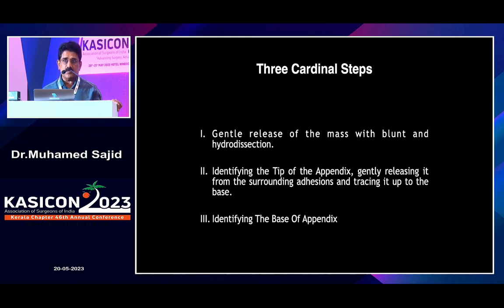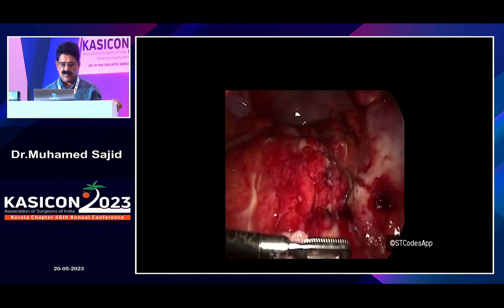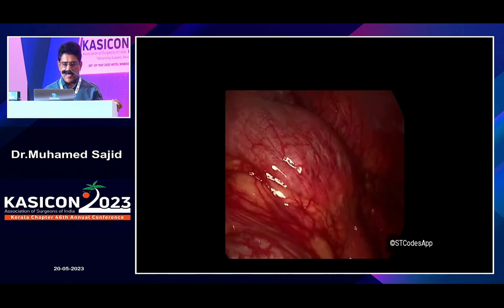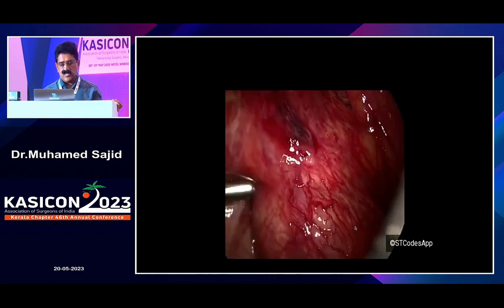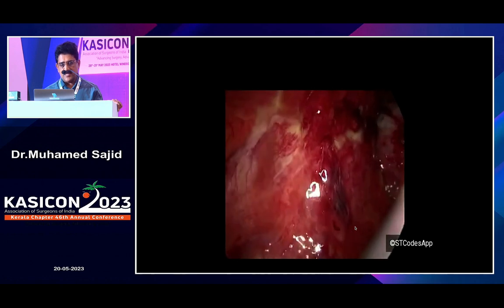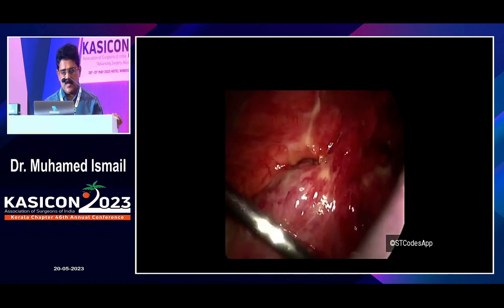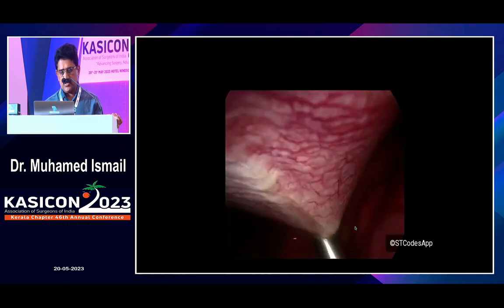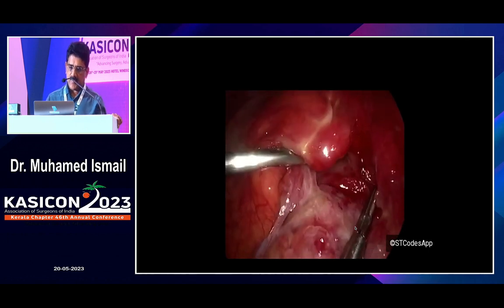Try to avoid injury to the cecum and other structures. This was the picture when we got him — there was a lot of pus in the pelvis. We tried to remove the adhesions. The cecum and appendix were actually pulled down into the pelvis with severe, dense adhesions to the sigmoid, so we were still not sure whether any diverticular perforation from the sigmoid was present.